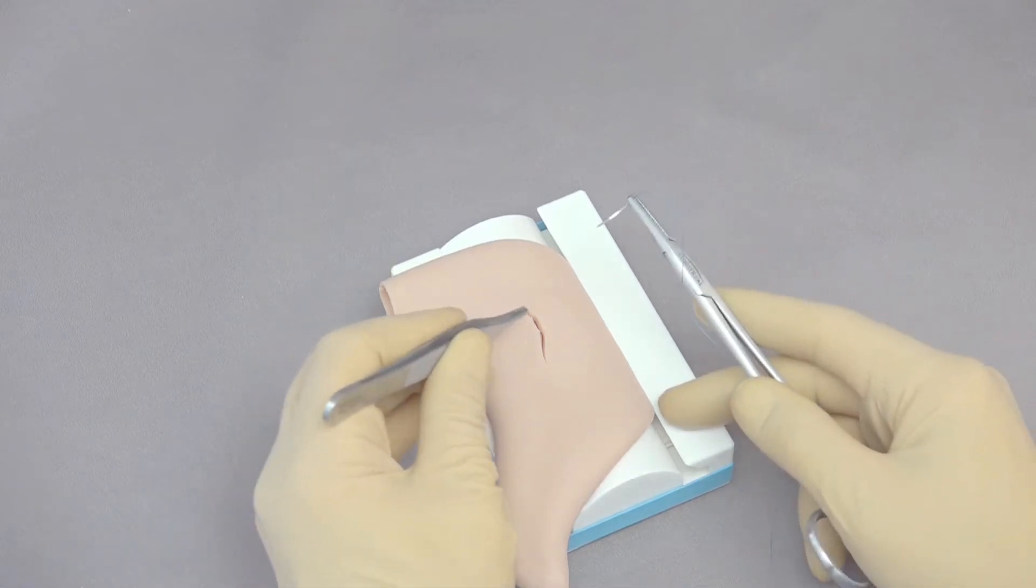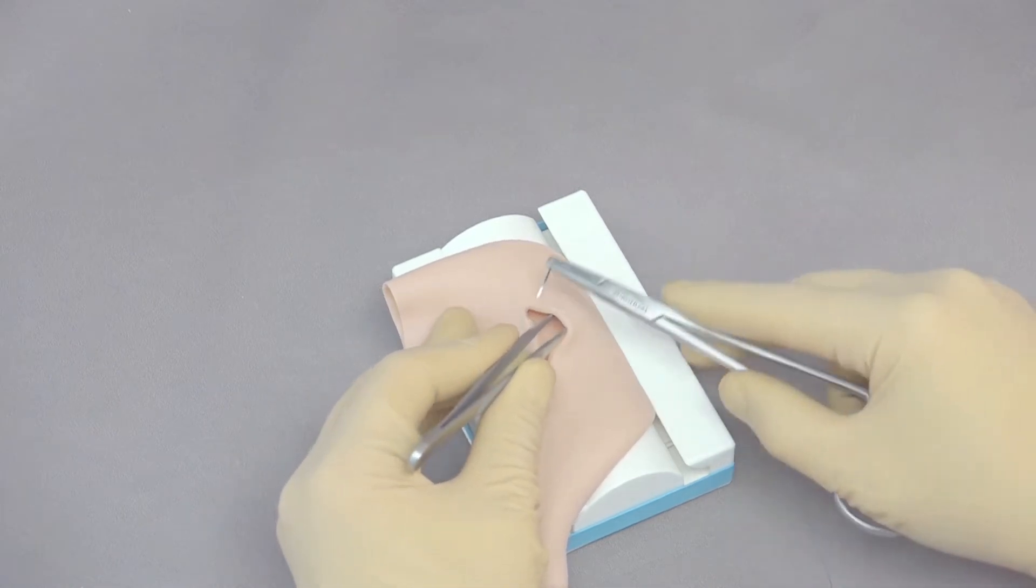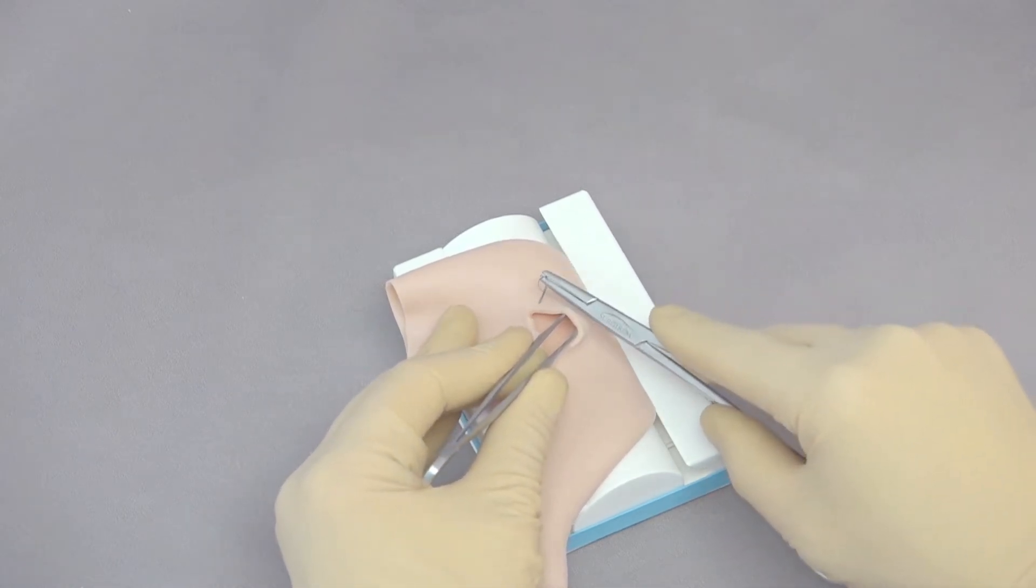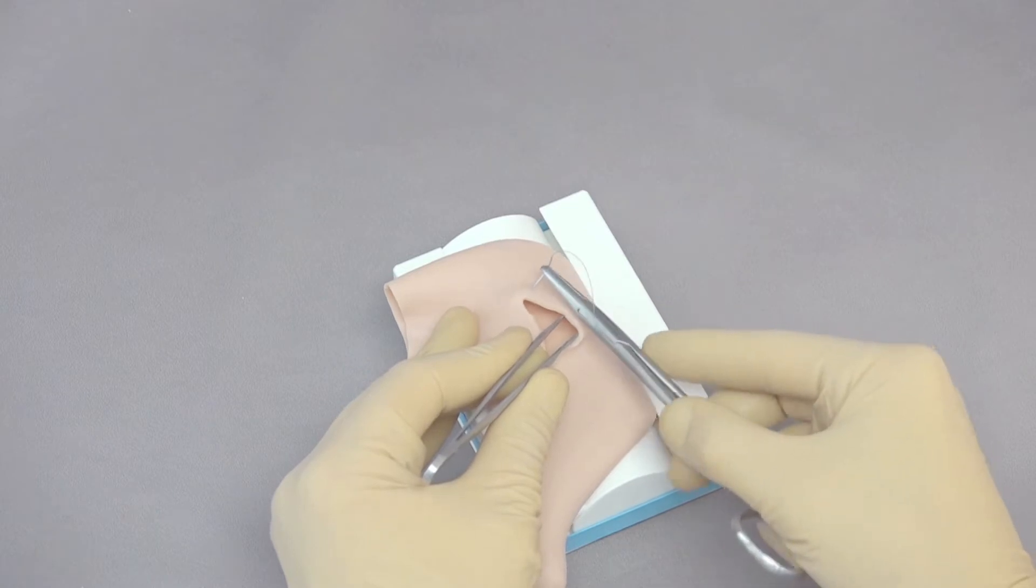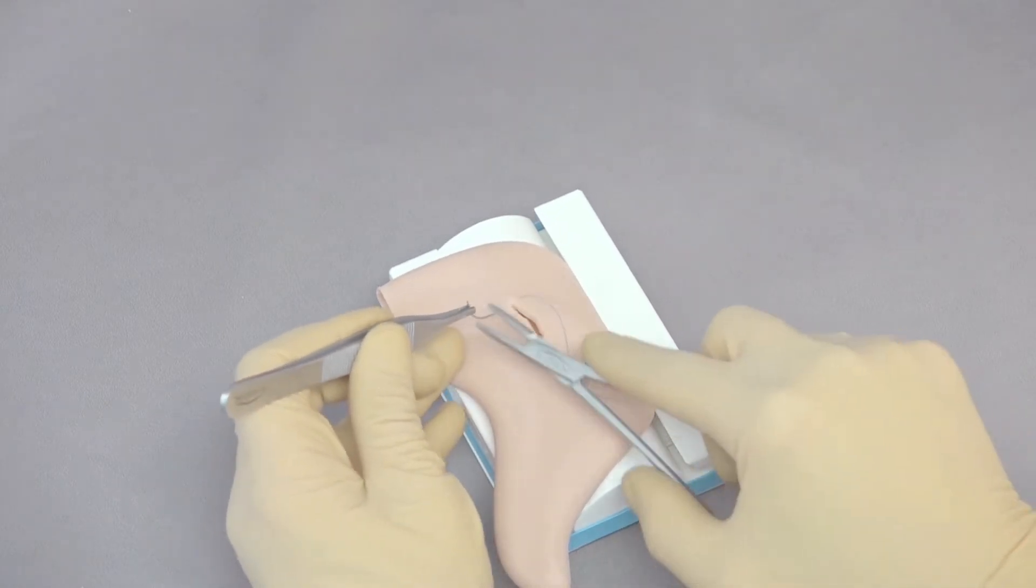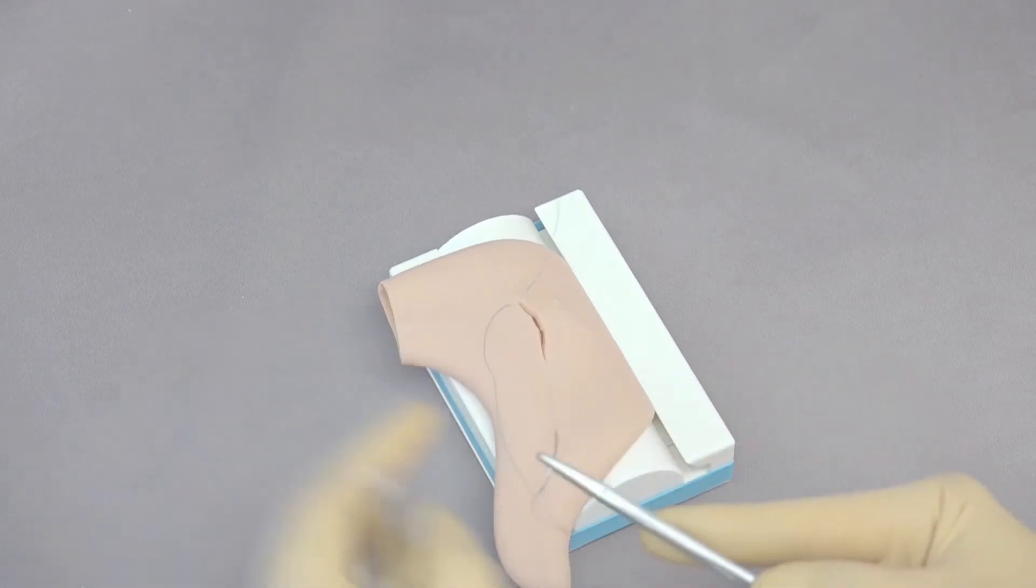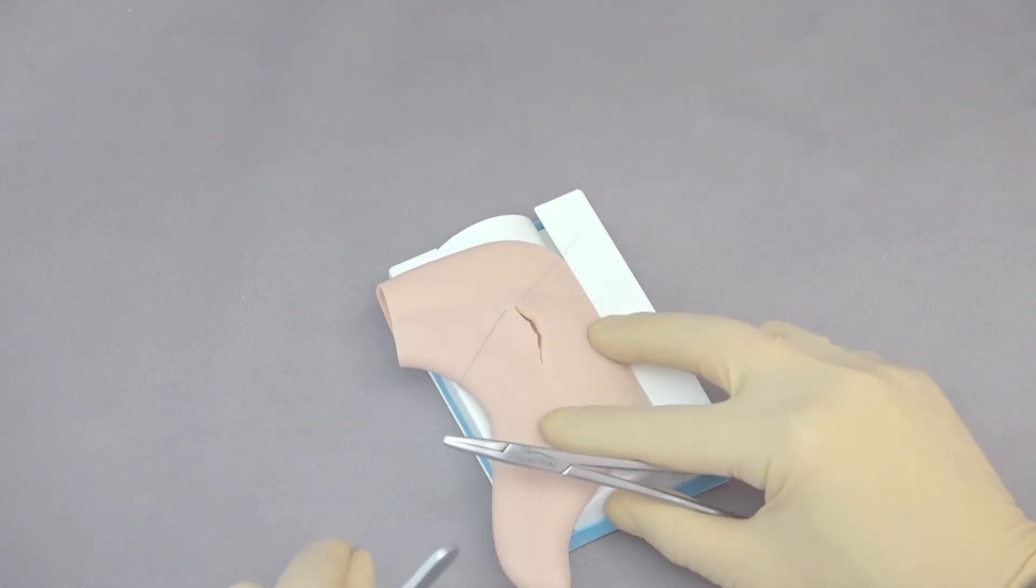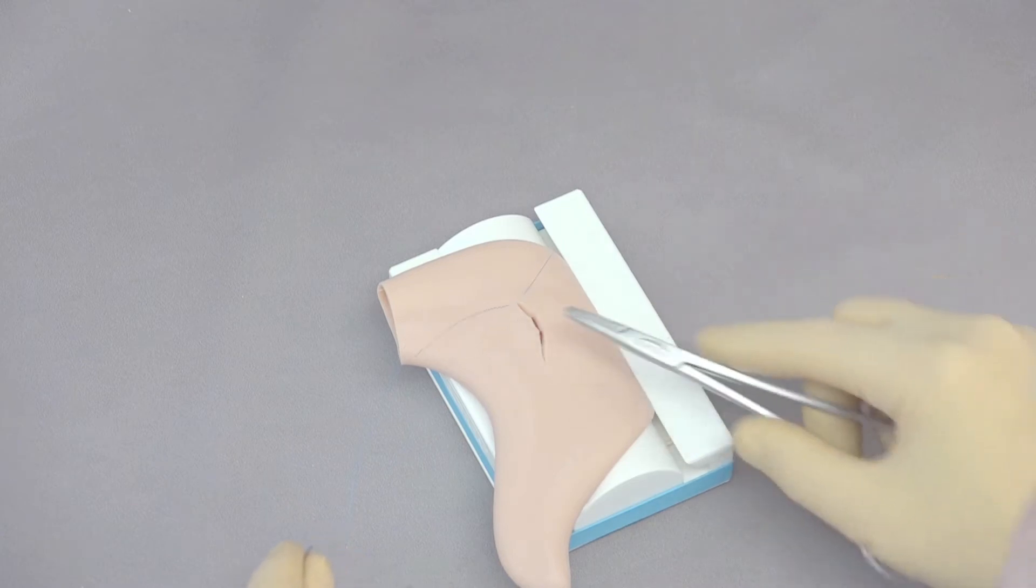The best way to do that is to put your thumb forceps inside to stabilize. Go just past the incision in the stomach, and make your first suture bite. By going past the incision in this case, it's going to stabilize the stomach a little bit better, and make sure that we've got a good closure.